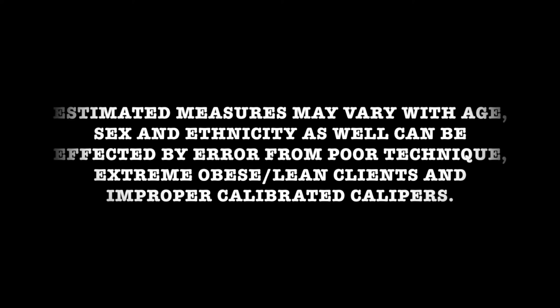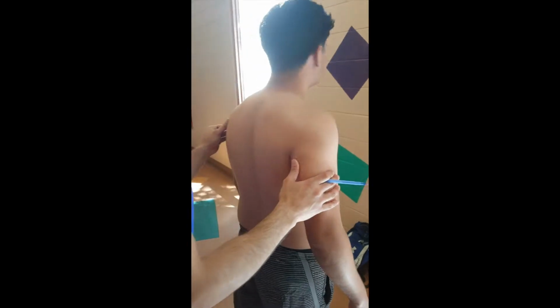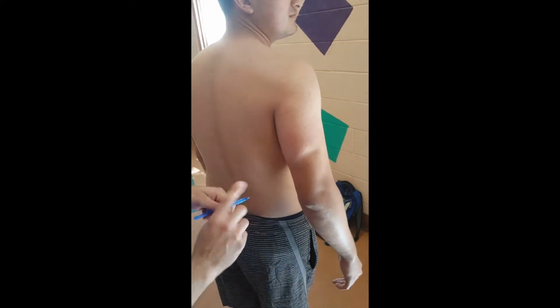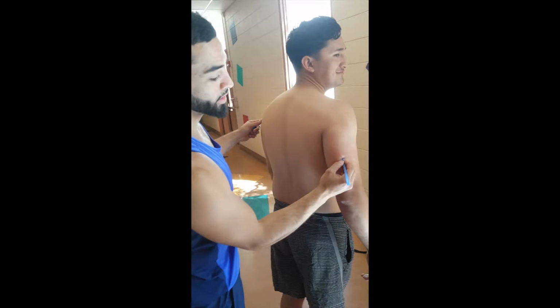Results may vary with age, sex, and ethnicity and can be affected due to error from improper technique, extremely obese and lean clients, or improperly calibrated calipers. In order to follow standardization of the technique, all measurements will be taken on the client's right side. The client's skin should be dry and lotion free. As well, measurements should not be taken immediately after exercise.